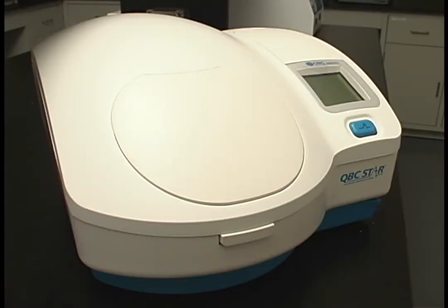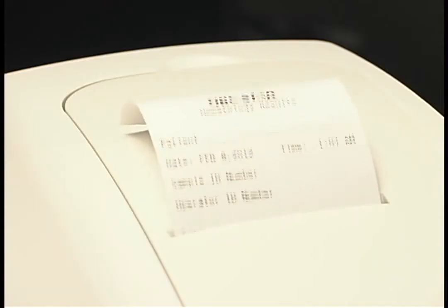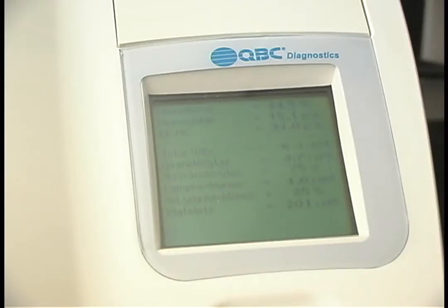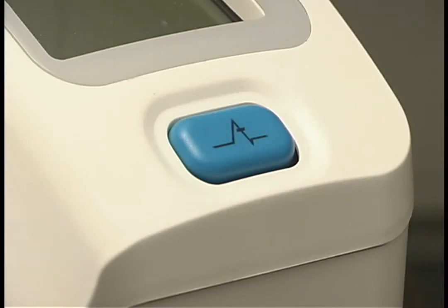Keep in mind that centrifugation is occurring at 11,000 RPM, so the noise level will increase. Centrifugation and sample analysis will take less than eight minutes. Patient results will be automatically printed and will also be displayed on the star screen until the door is opened. If you would like additional copies, press the star button before opening the door. Once the star door is opened, results will no longer be available for printing.